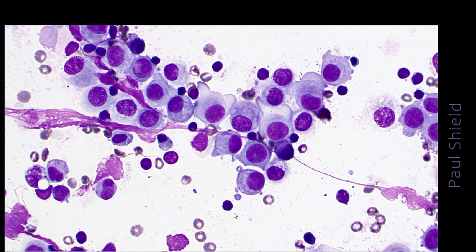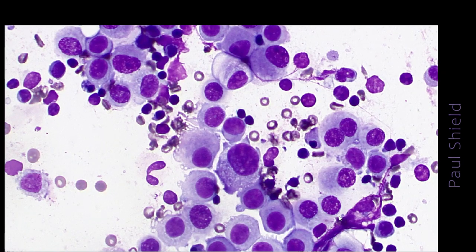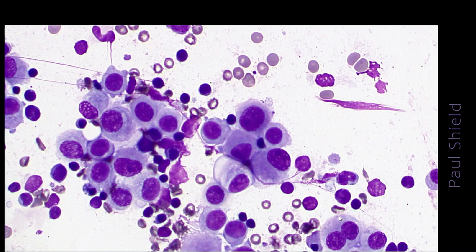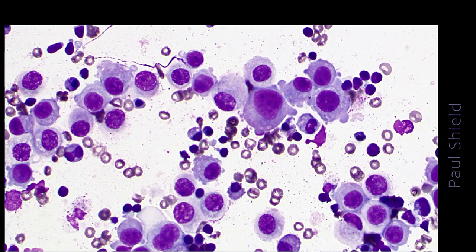It's also hard to judge on a Giemsa, but I think these are quite hyperchromatic. So I'd be really wanting to check that out in detail on the pap stain. And I'll be looking around for vacuolation that would be not typical of mesothelial cells, and for groups of cells that are not showing windows. These are just not looking right for mesothelial cells to me.